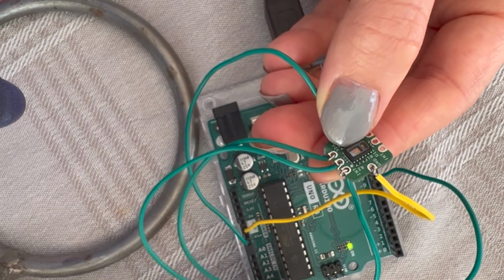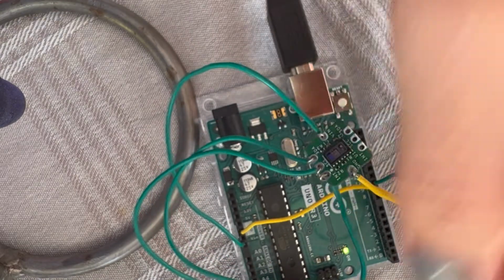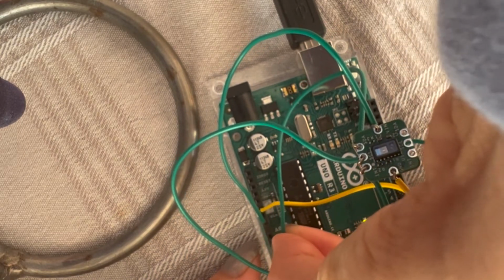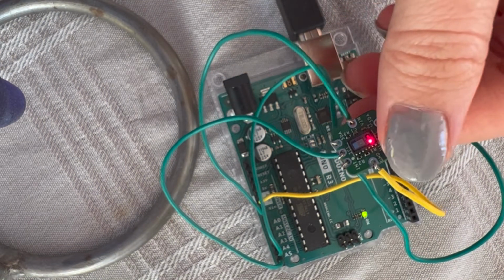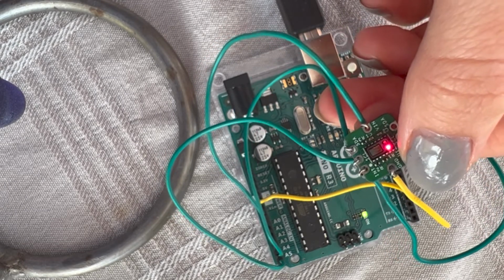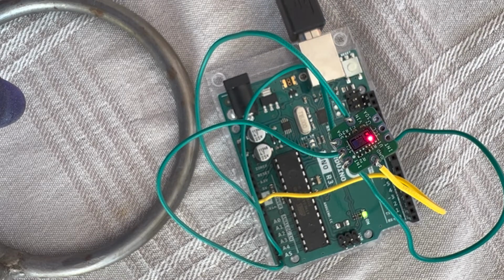Okay. Sorry about that. Yeah. So when I explained it the first time, I think I got it wrong. But as you can see, SCL is connected to A5, and it's the middle one. SDA, which is the corner one, is A4. As you can see the red LED turns on, so that's a good sign that it's working.